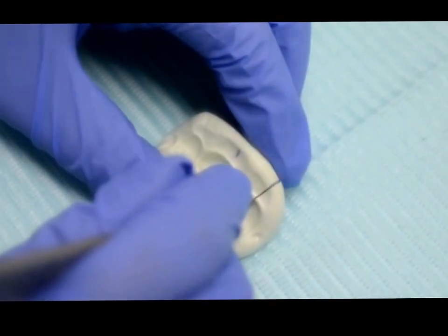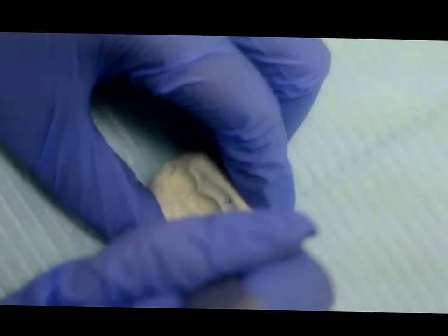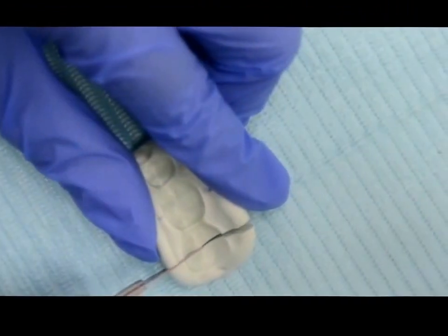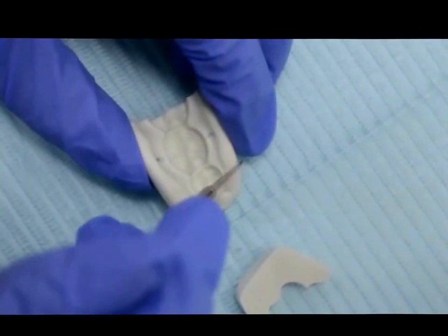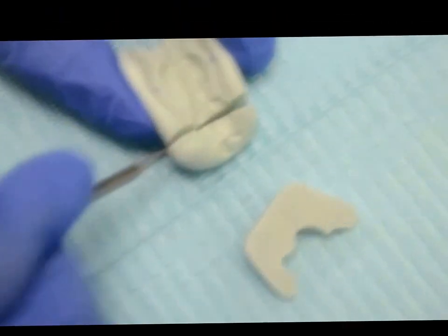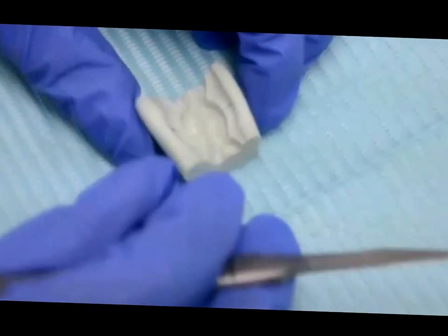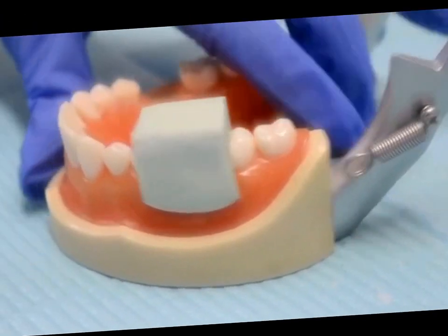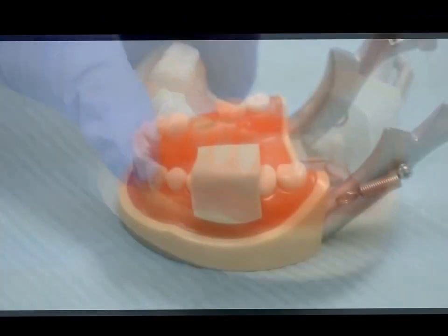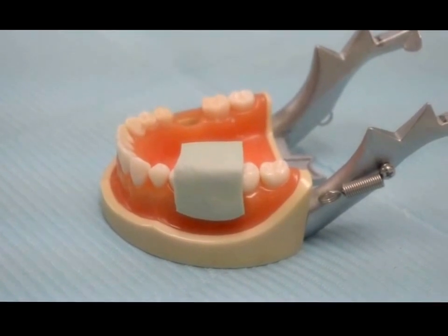Once the material has set, remove and cut away excess with a sharp scalpel. Try in the putty matrix. Cutting away the matrix over half the adjacent teeth allows for easy visual inspection and adds stability.